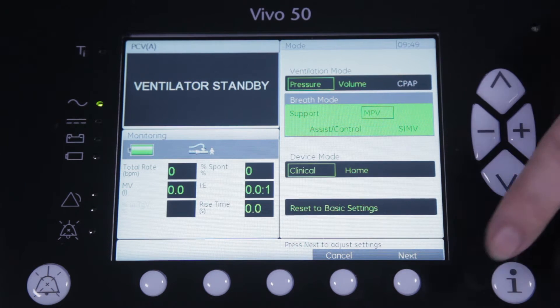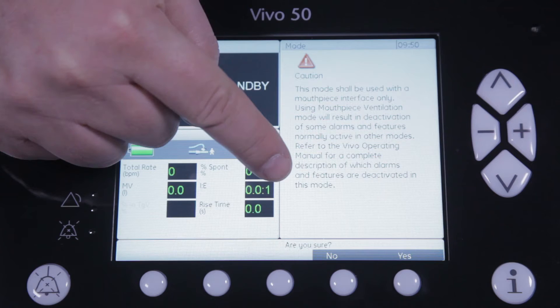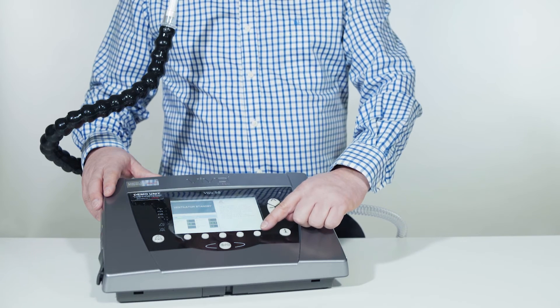By pressing next, the Vivo will automatically guide you to the settings page. But before entering the MPV mode, you will as a user see an information message to inform you about the difference between MPV and the other ventilation modes.